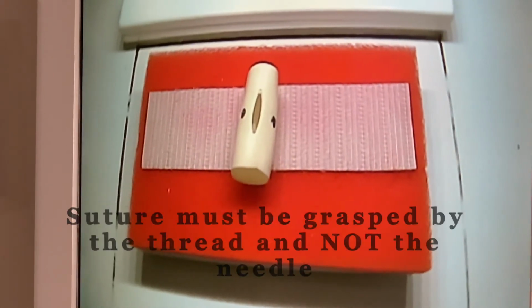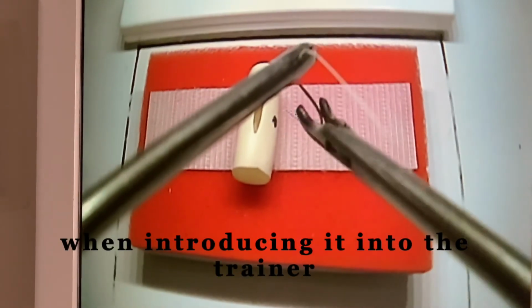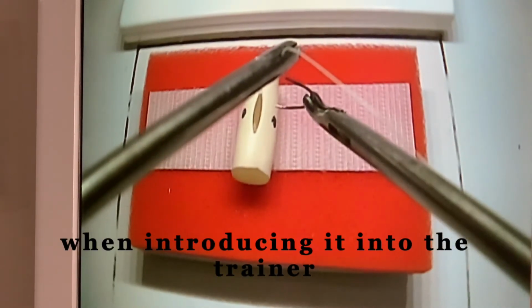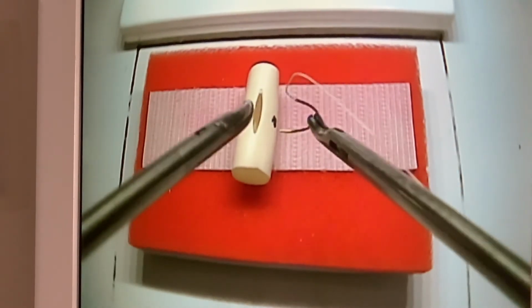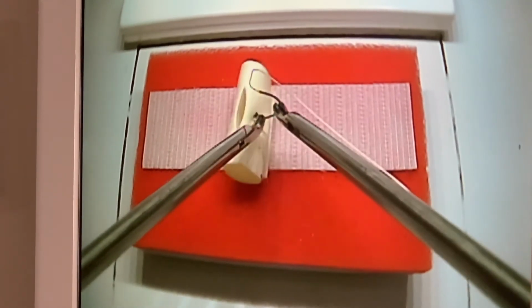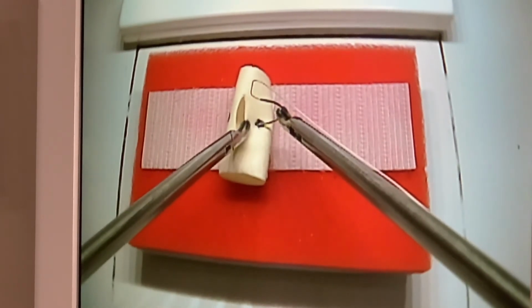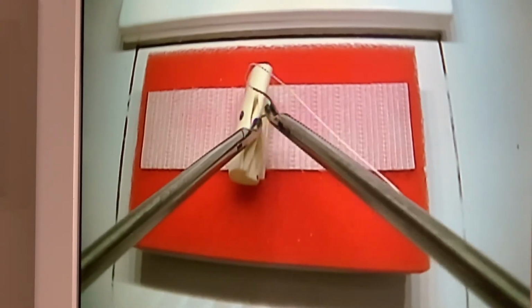Task 4. Extracorporeal knot tying. Taking a long suture and your needle drivers, you will place the suture through both ends of the Penrose drain and tie 3 single throws extracorporeal. You will utilize the knot pusher to secure each throw onto the Penrose drain. Then you will cut the excess length of suture.